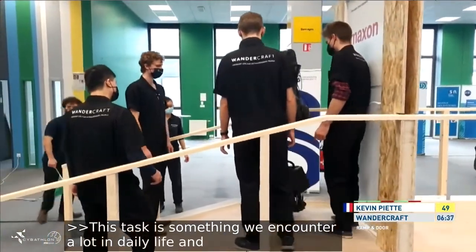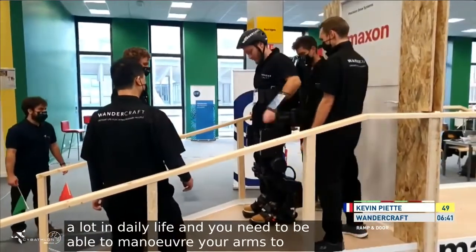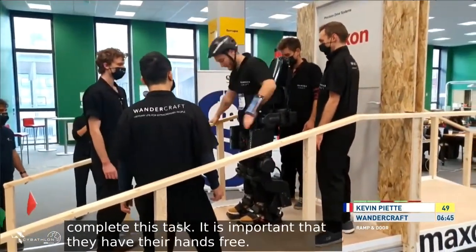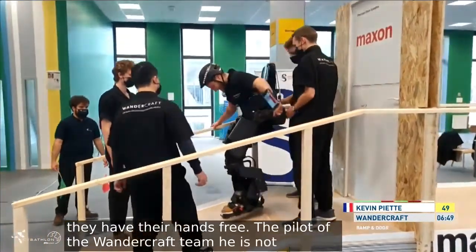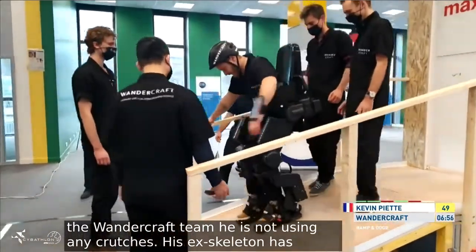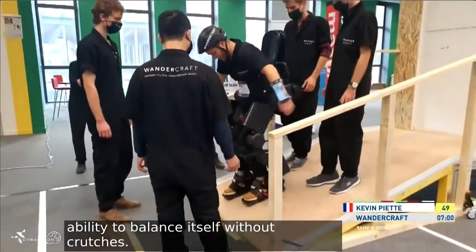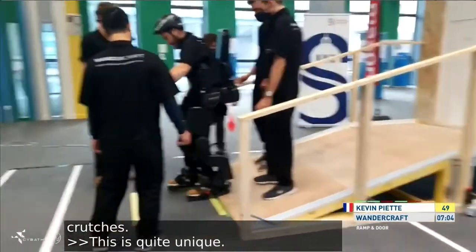It's important that they have their hands free, as you see here with the Wandercraft team. His hands are completely free — he's not using any crutches — because this exoskeleton in particular has some capability to self-balance itself. So he's using his hand on the guardrail there, but no crutches compared to the other teams. This is quite unique, this development of the Wandercraft.